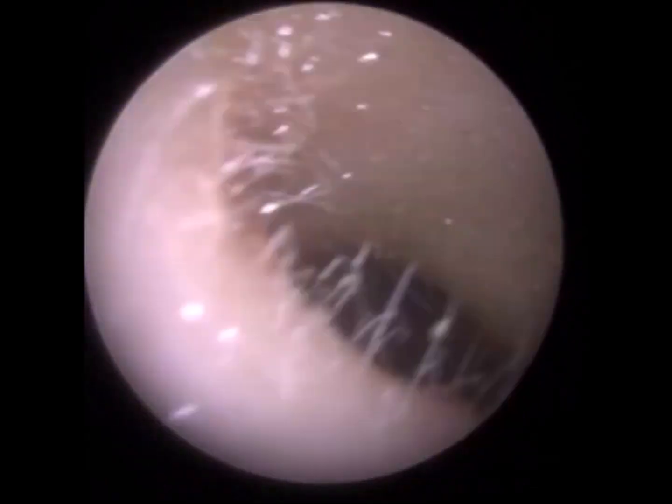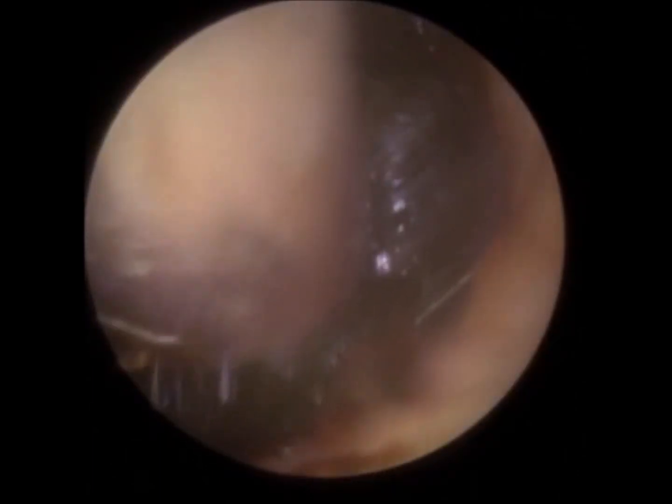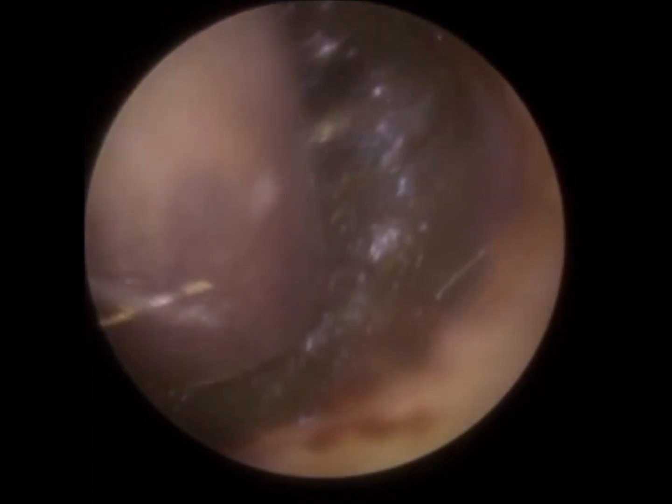And because it's such a gradual change, the patient is almost unbeknown to this slow deterioration. If they lost their hearing overnight, suddenly then they had that reference point from the night before, and they realise that, oh God, my hearing has significantly deteriorated. And I suspect in some ways this is what's happened with this patient. This wax is almost black, so it's oxidised. We know it's been there for a long, long time.